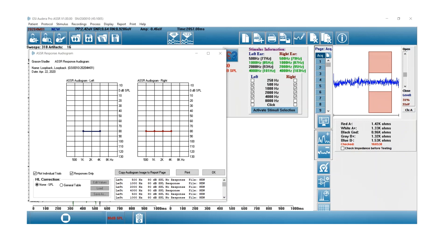you may want to decrease in intensity and obtain those thresholds for the right ear, and then go back and retest some of the other frequencies in the other ear.